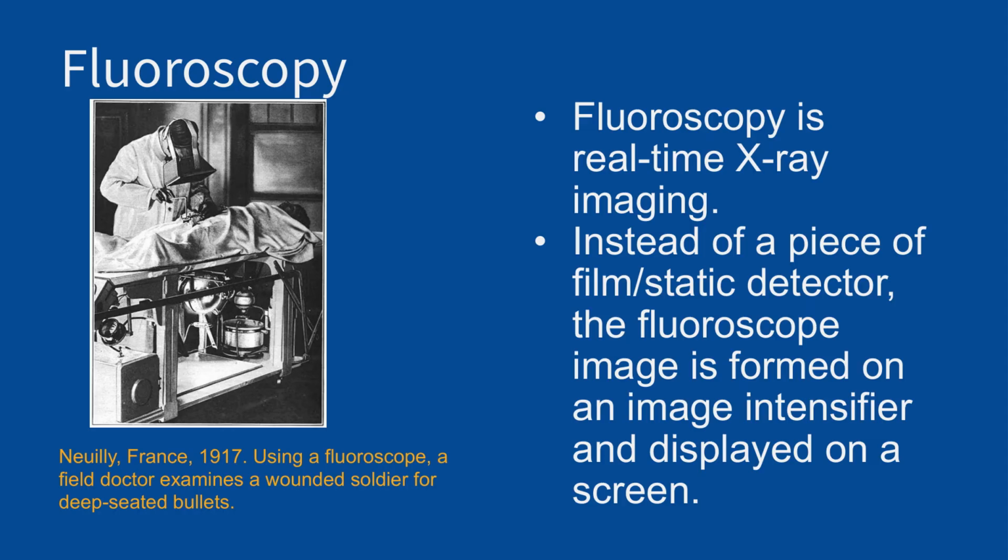Now, we have spoken about X-rays in general. We have so far not really spoken much about fluoroscopy. Fluoroscopy is really nothing but real-time X-ray imaging, where instead of a film or a static digital detector, we use an image intensifier, or nowadays also a digital detector, but something that is capable of giving us a continuous view of the X-rays that are hitting the detector.